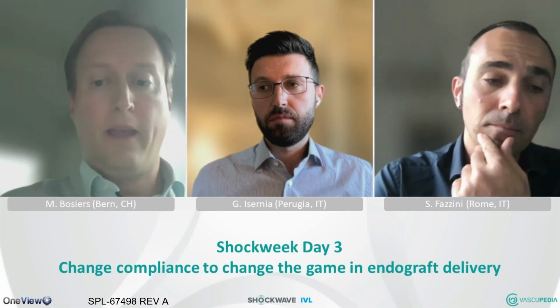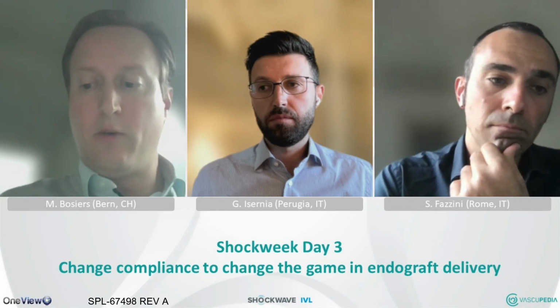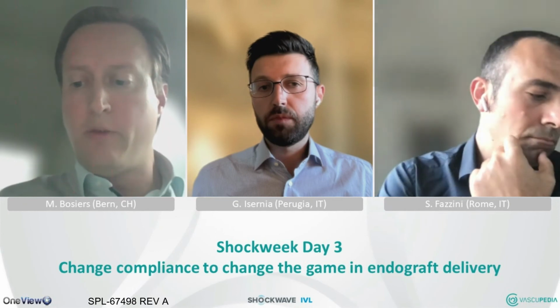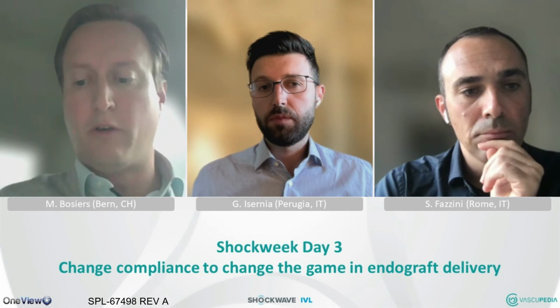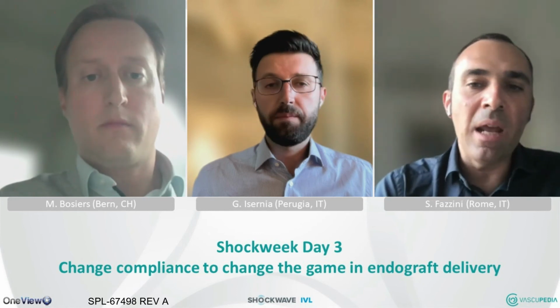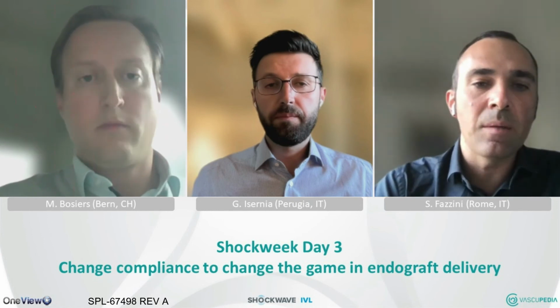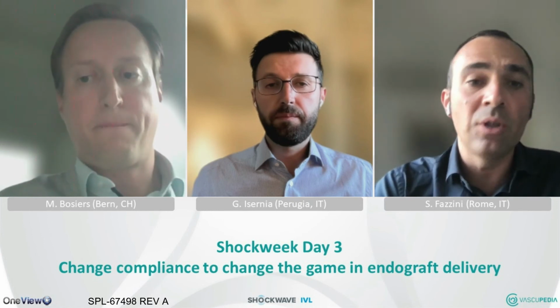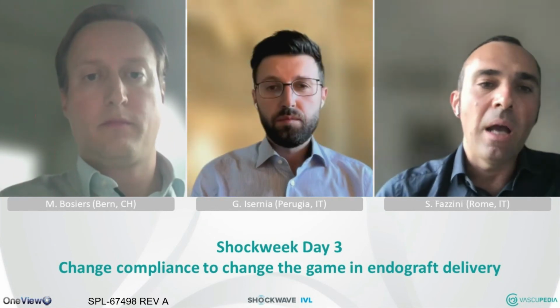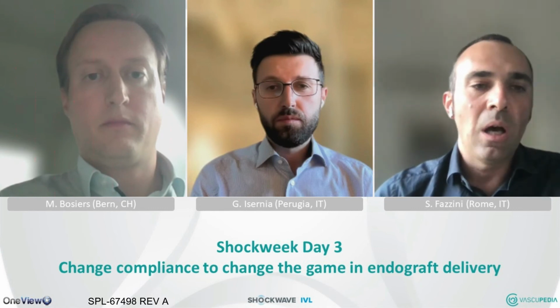Fully agree, Stefano. A question from the audience: have we experienced any embolization so far, peripheral embolization? I didn't have any embolization, neither for iliac cases, because I'm using lithotripsy also for peripheral iliac cases, not just in case of associated aortic aneurysm, and also for FEMPOP disease.